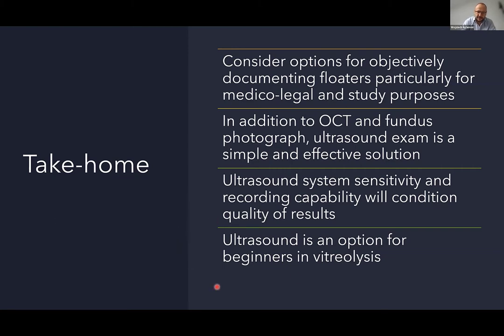And I especially like to stress that ultrasound is a good way to visualize the whole vitreous and to visualize the aspects of floaters and the rest of the eye in terms of a 3D visualization. For beginners, it helps a lot for the learning curve. Thank you.